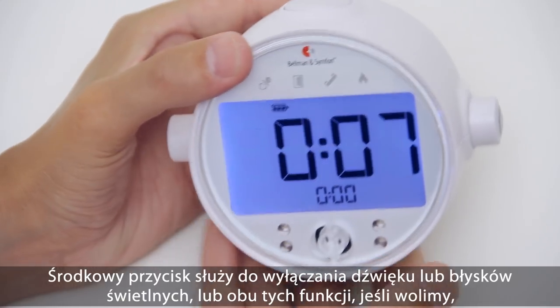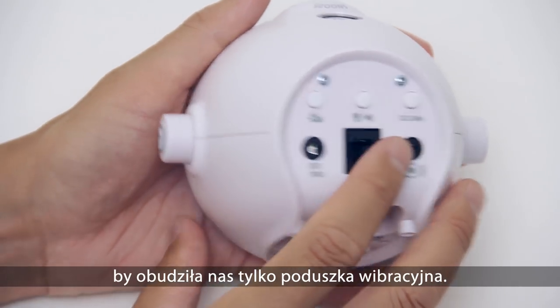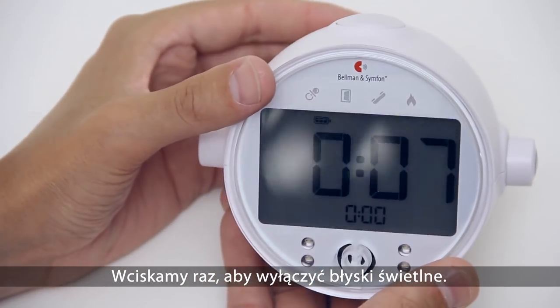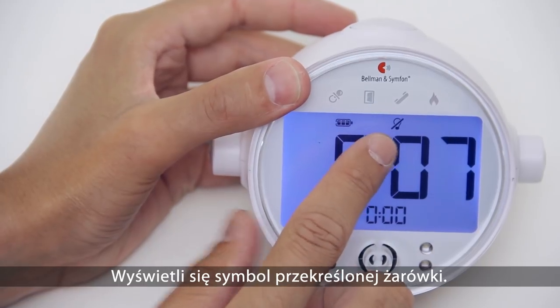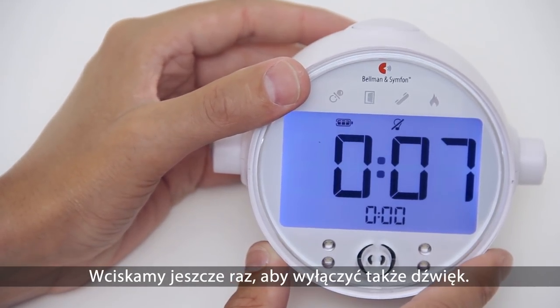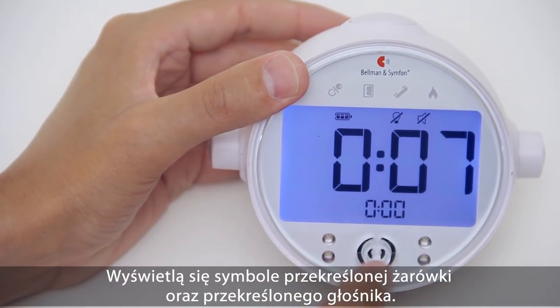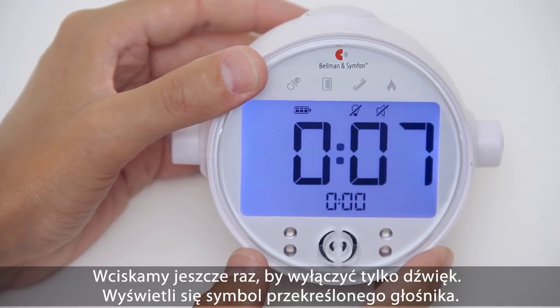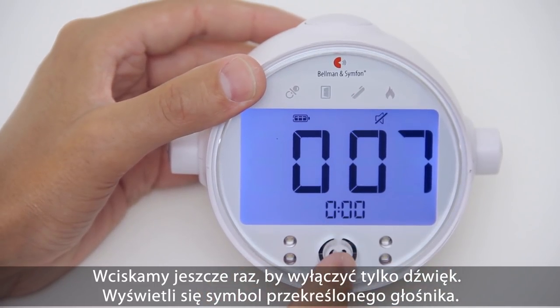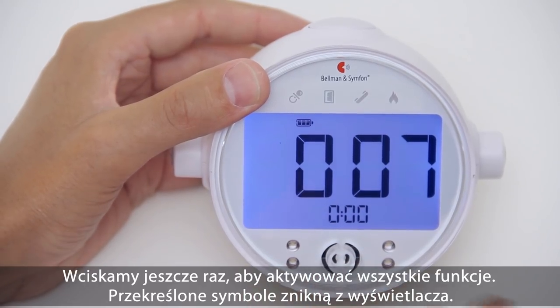The middle button will turn off the sound or flash, or even both, if you prefer to wake up just using the bed shaker. Press it once to turn off the flash — this is indicated by a crossed-out light bulb. Press it again to turn off both the flash and sound, indicated by a crossed-out light bulb and a speaker symbol. Press it again to turn off just the sound, indicated by a crossed-out speaker symbol. Press it one more time to reactivate all functions — all crossed-out symbols will now disappear from the clock face.